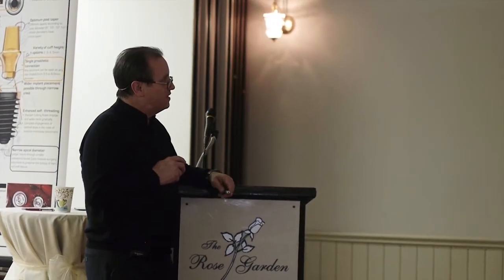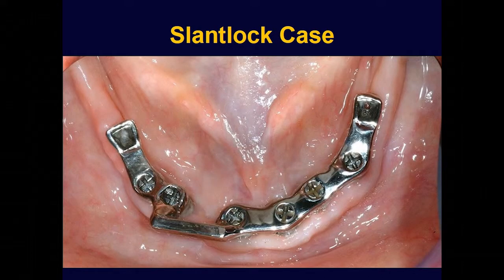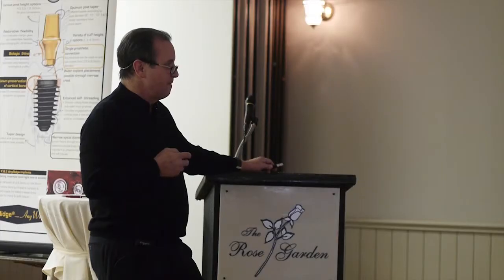So we look at some of these different things that are out there. There was a slant lock, Dolder bar with the Hader clips, which we don't do anymore. Bar with locator attachments, which is fine, but we do a lot more individual locators rather than using a bar, just because it's a lot easier. This was kind of a craze way back when, where you've got a bar where the distal feet are kind of angulated. They call it slant lock, where the denture, the superstructure slides into these feet. Then you have a little latch that latches under here. It really works well, but it's a lot of lab stuff and commotion. And if you have to go back and make another denture, here's your substructure inside of here. You have to make all that over again. So we didn't do a whole lot of these, but this is an old case.